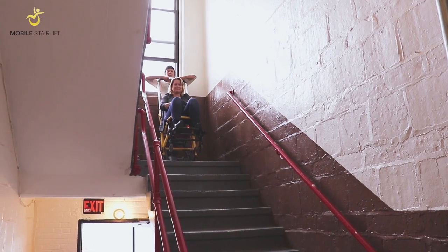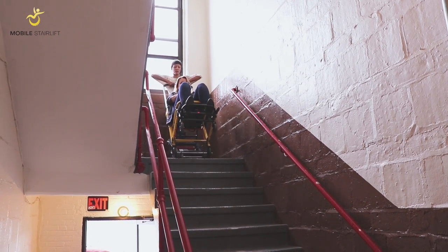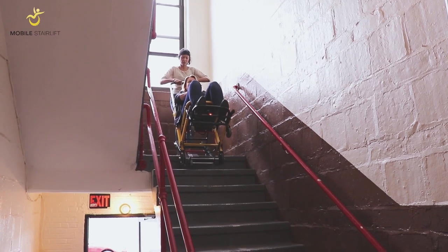When you are descending the stairs, it may help to move in short bursts until you are comfortable balancing the Stair Lift at the correct angle as you move forward to begin your descent.